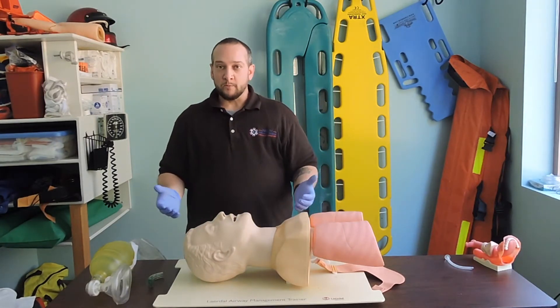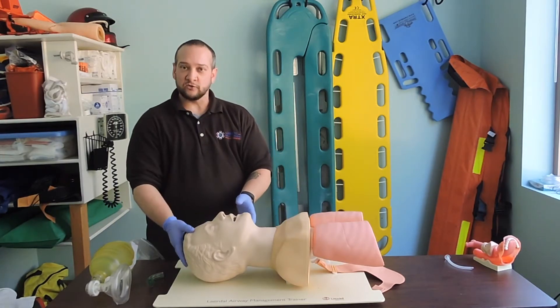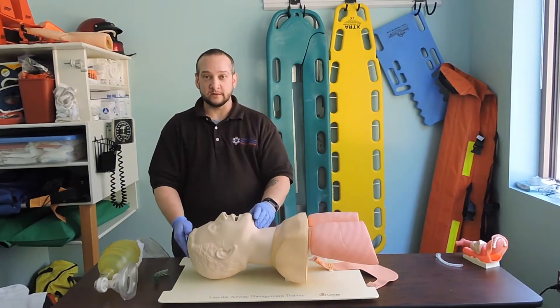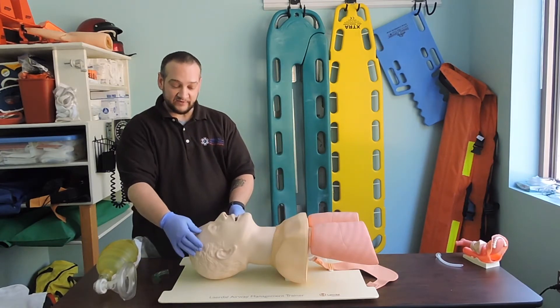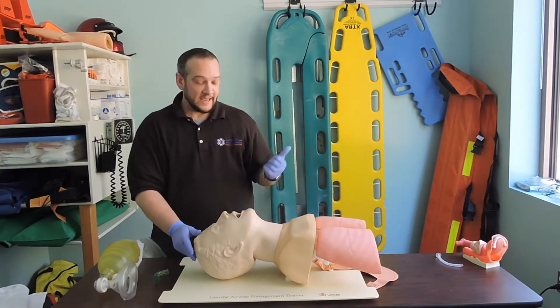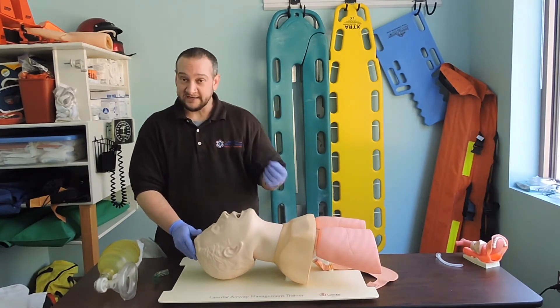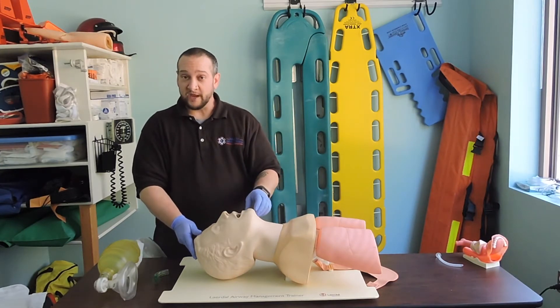We pick the proper method to open the airway — that's the first thing we need to do. The second part of airway management is checking if the airway is patent. Once we have the airway open, we want to take a look in — looking for any vomitus, any sputum, any foreign body that could be occluding the airway. Do we need to suction? Is there anything that needs to be removed?